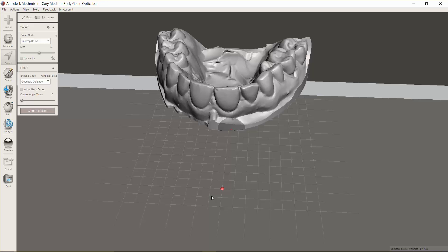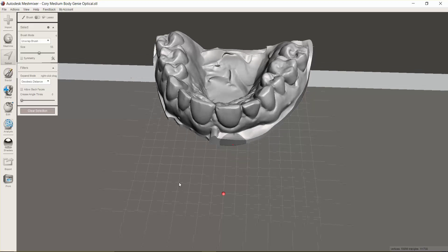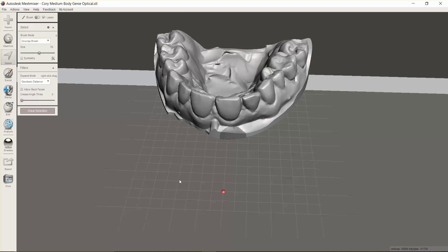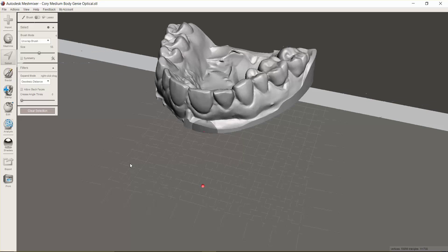You can use the cut tool in Blue Sky Plan, but sometimes that's just not as precise. Autodesk Mesh Mixer is a free program that you can download that has a lot of really powerful CAD/CAM tools in it, and I'll show you a couple of simple ones that you can use to make the ovate pontic site.